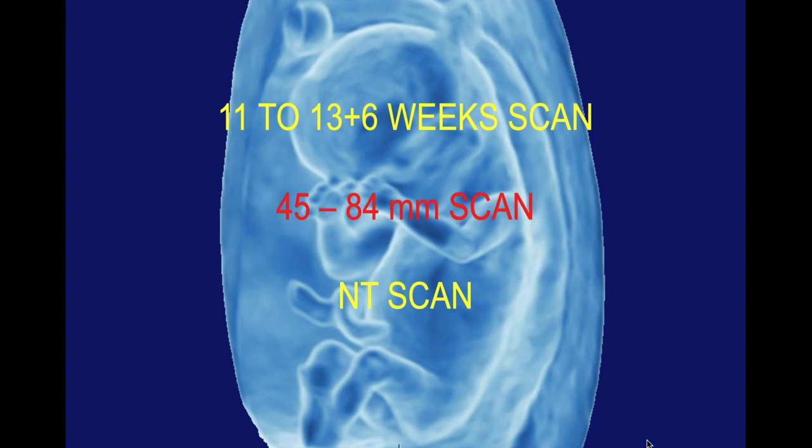11 to 14 week scan, otherwise called the NT scan or the 45 to 84 millimeter scan. We will see the guidelines and protocols for this scan.